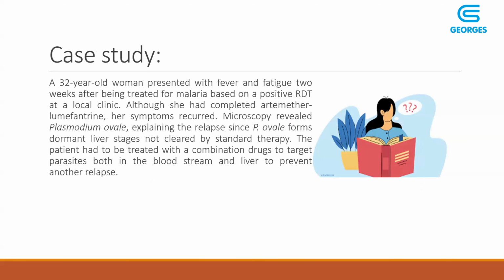So let's begin with this quick case study where a 32-year-old woman presented with fever and fatigue. That is 2 weeks after being treated for malaria based on a positive RDT at a local clinic. Although this patient had completed artemether-lumefantrine treatment, her symptoms recurred. This is after 2 weeks. So after 2 weeks, a microscopy was done. It revealed Plasmodium ovale. So this explains the relapse of the fever and the fatigue.